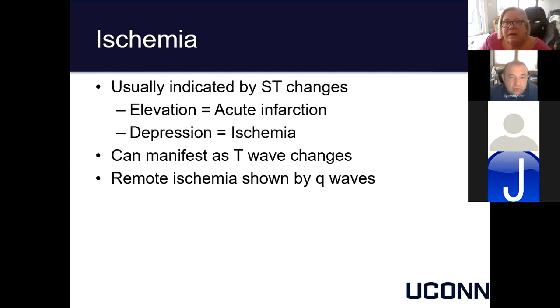Tall, sharp T waves, you can be suspicious of that. But it may be hyperkalemia, so you need to look at the clinical picture. I was just going to say, you need to take that whole picture into consideration. Exactly. And the concept of a non-STEMI, non-ST elevated MI, I'm going to say didn't exist until the mid-90s, maybe, until fast markers like troponin and MB fractions were discovered. Otherwise, you just cannot judge if it's damage or just ischemia.